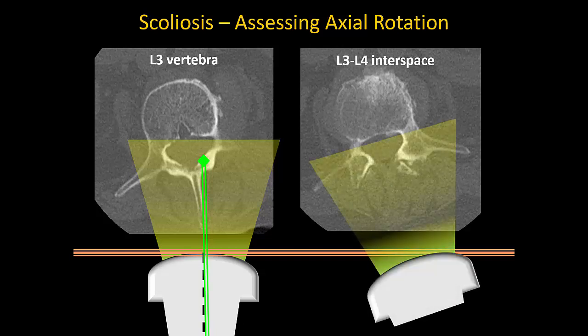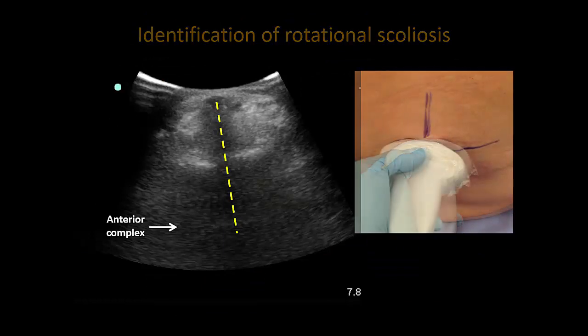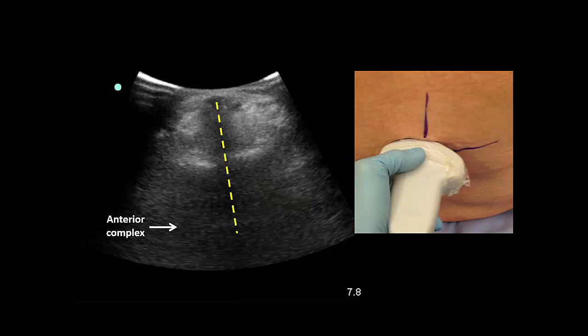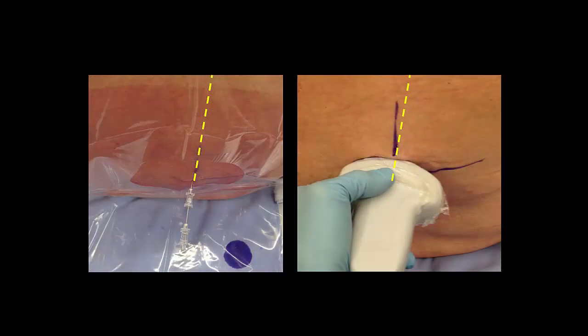The beauty of ultrasound is that we can rotate or angle our probe to bring the beam into line with the axis of the spine, and thus we determine the angle of rotation and consequently the angle of insertion for our needle. Having noticed that the spinous process shadow is tilted when the probe is perpendicular to the surface of the back, we angle the probe towards one side or the other to bring the shadow into a vertical position. This, then, is the angle at which the needle should be inserted for a midline approach to the vertebral canal.